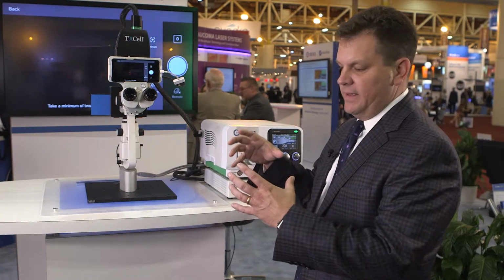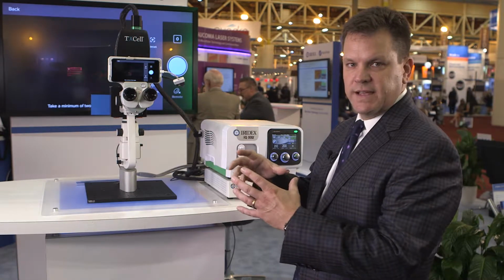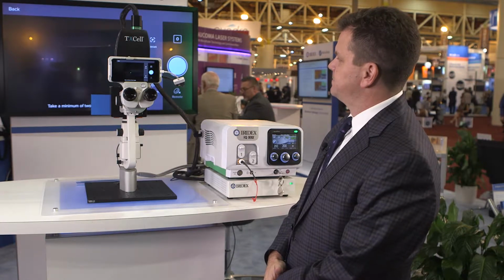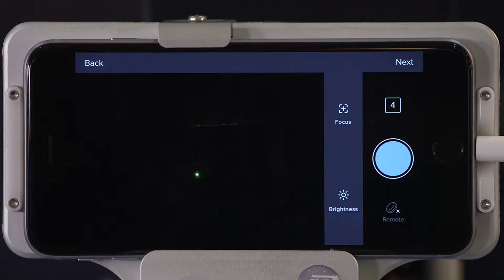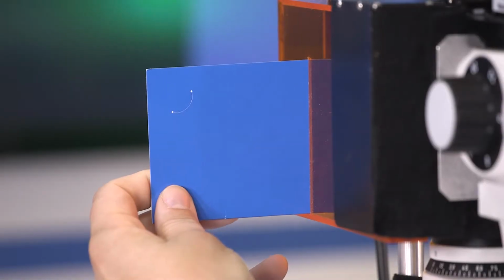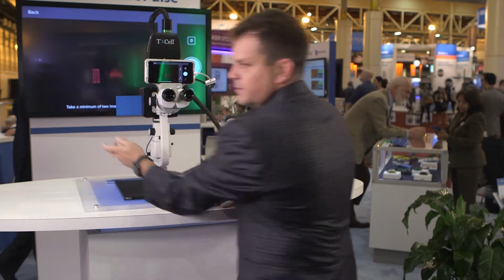What I want you to look at is the actual thermal spread of the heat elevation in the tissue as you're firing the laser. It's around the grid in the continuous wave mode. You see that as the tissue is heating up around, you get this spread of heat that's causing a scotoma in the human retinal tissue. Now we're going to move the card to show the comparison between using a continuous wave laser and using a MicroPulse energy at 5% duty cycle.